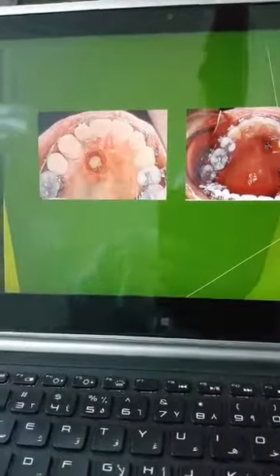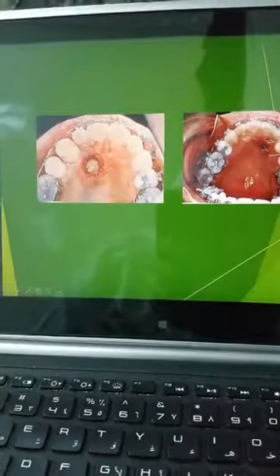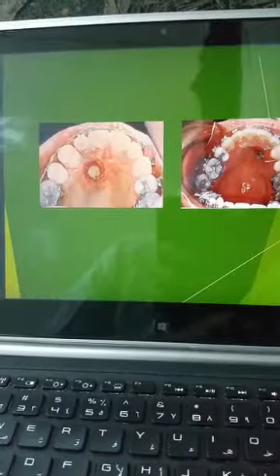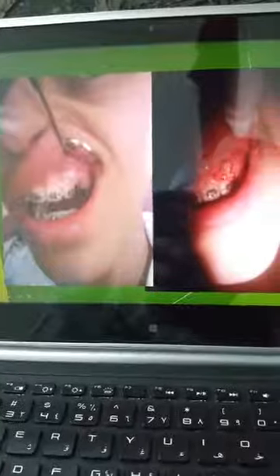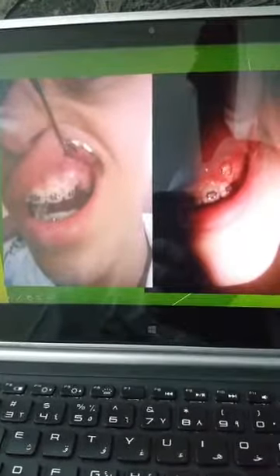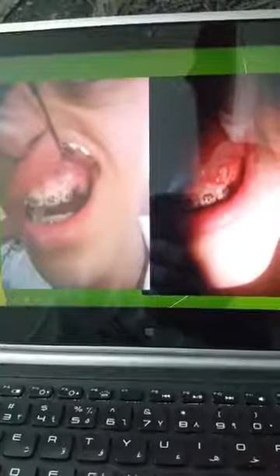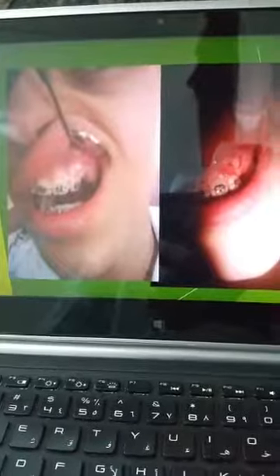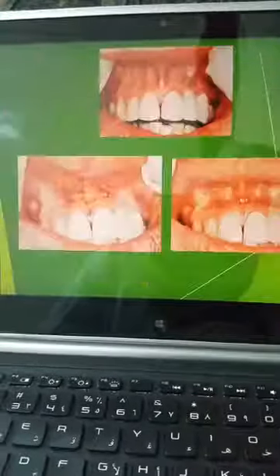You can expose the soft tissue over the impacted canine. I love to use the Er:YAG laser because it's very safe on the tooth itself. Like in this case, I did it. This is a 15-year-old boy. I exposed the canine, and I was not worried that the laser would be directed to the pulp because it was an Er:YAG laser and there was not too much bleeding in this area, so I can control the bleeding even with local hemostatic agents in this case if it happens.